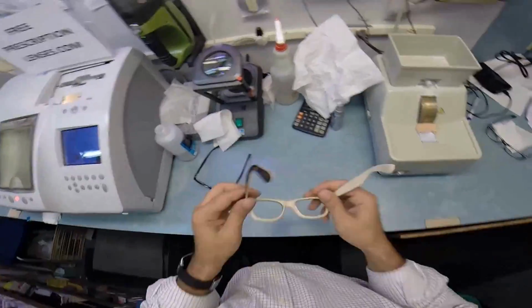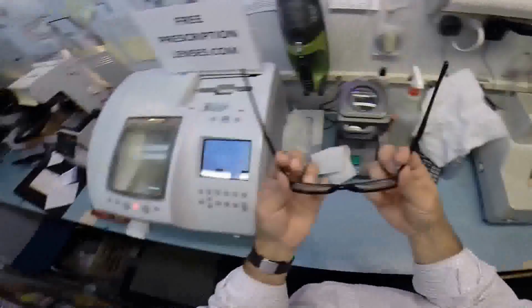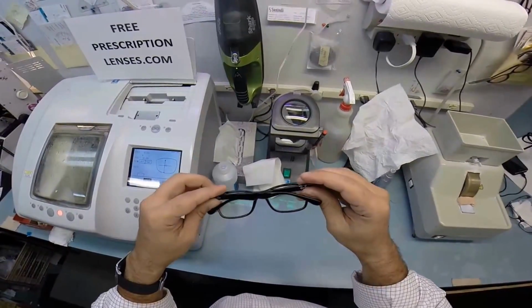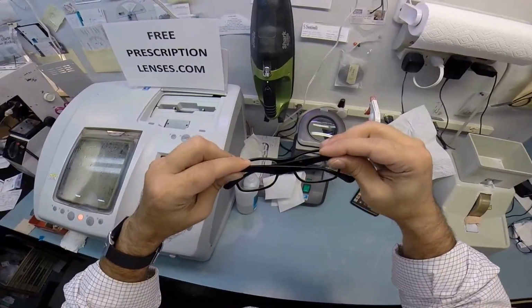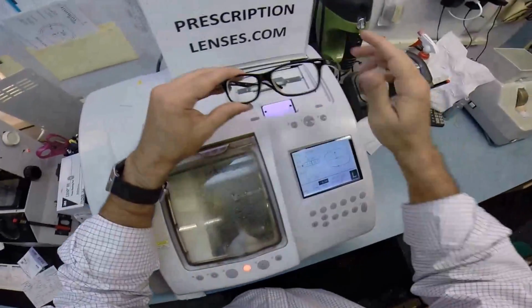So put these back on so I can see what I'm doing. I'm going to make sure there's the same amount of tension on each spring hinge, and there is. I'm going to make sure the temples overlap, that they're not skewed, and they are not. So that is that. Kathy in Austin, Texas.